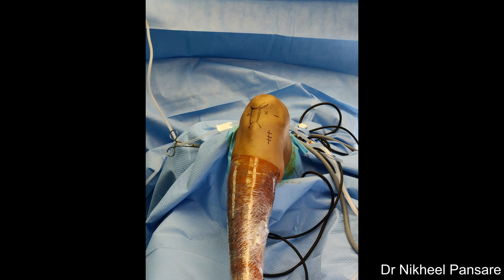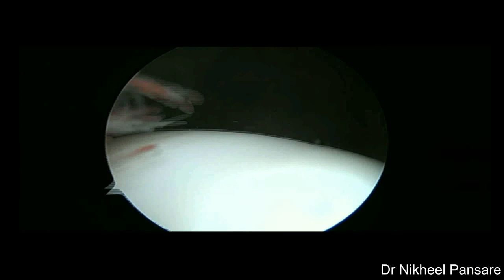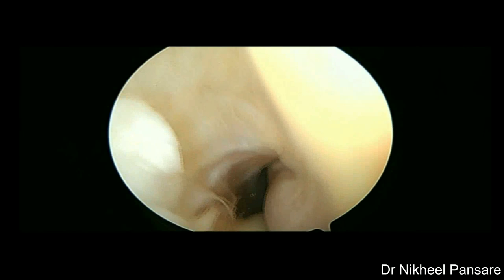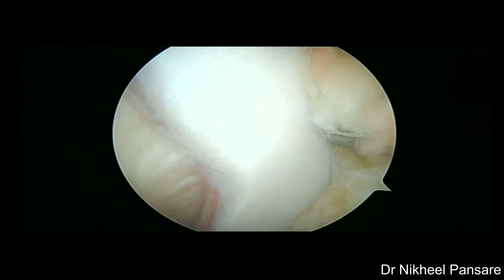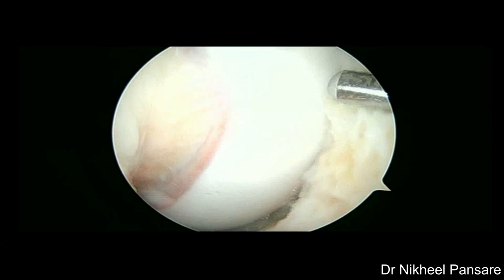We prefer to perform diagnostic roundup before harvesting graft, even though the diagnosis is confirmed preoperatively. Examination of suprapatellar pouch and patella cartilage, then lateral gutter — the most common site to find loose bodies — then to medial gutter and then into the notch. Excessive infrapatellar fat pad is shaved off to visualize the operating field, taking care not to damage cartilage and other important structures such as intermeniscus ligament and meniscocapsular junction.